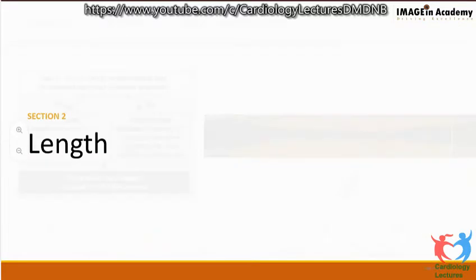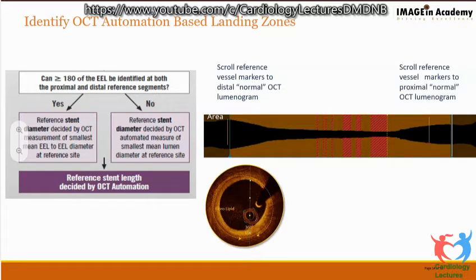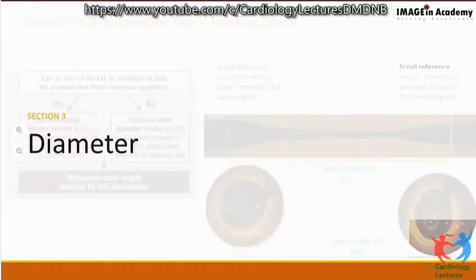Now, when we mark these proximal and distal references, they help us find out what the length will be. And I mentioned that EEL is very important. You should be able to see about 180 degrees of EEL, and this segment has to have less than 50% lipid. So if you've been able to identify EEL, use EEL. If you've not been able to identify it, then use the lumen dimension. After having marked the proximal and the distal reference, we get the length. Now, if it is about 18 millimeters, we do get a stent which is 18 millimeters. So we select a stent size of 18 millimeters.